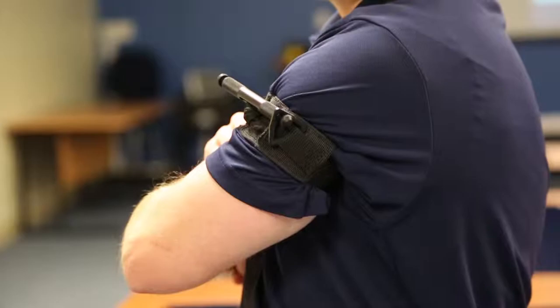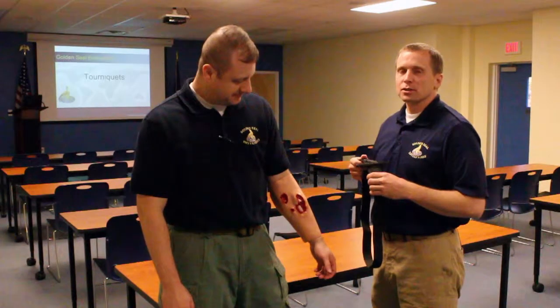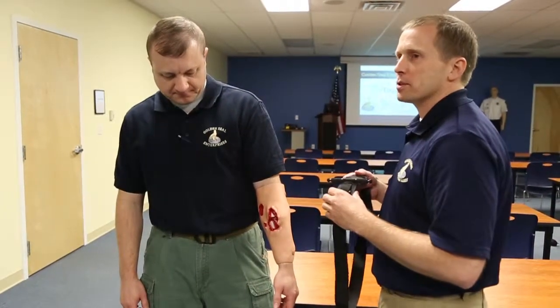Once it's in place, you simply leave it in place until the casualty or the person that's been injured has been taken to a medical care facility. Although tactical tourniquets are designed to be used one-handed, many times it's difficult for the individual that's been injured to apply them to themselves.